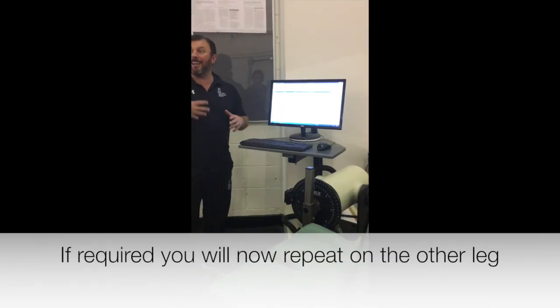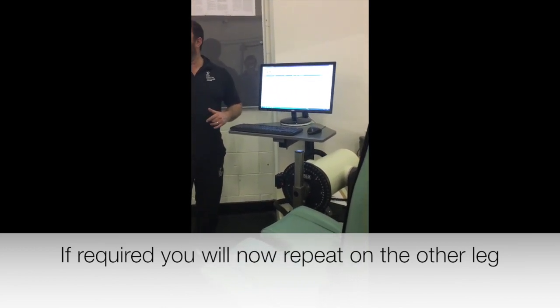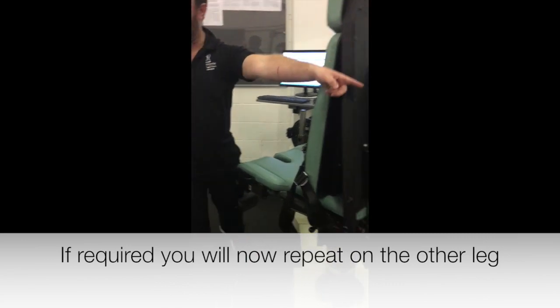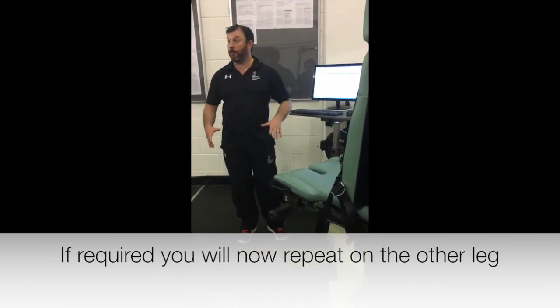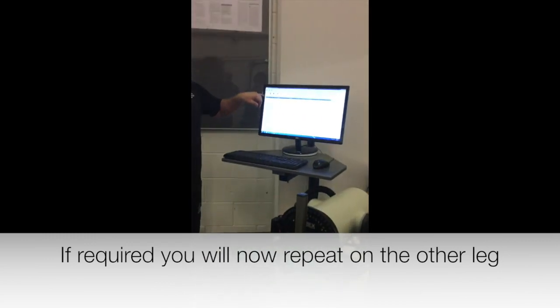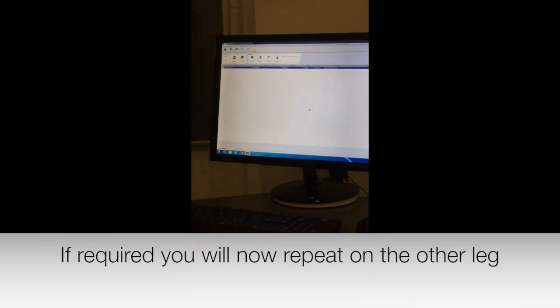That's it, done. So I can let you out now. Side, the machine tells you, so you just go back through the setup screen. Where it's gone green will now go black, and you're just turning everything around. My advice would be when you turn the client, turn them that way, so they're not banging into this. If you're doing left and right leg, if you're just doing one leg, that's absolutely fine. And then you just click all or single sets again, but change that to left, and it just talks you through the whole process again.